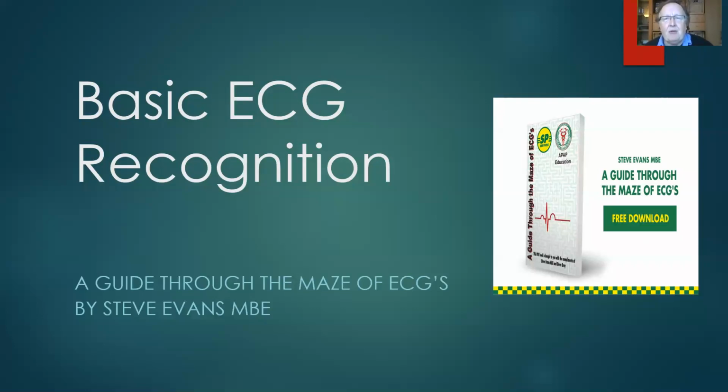And the other thing to remember when dealing with ECGs, it's only one piece of a 10-piece jigsaw. When you're trying to work out what's up with your patient, you need to get all the pieces, or as many pieces of the jigsaw together as you possibly can. So you're going to look at the levels of consciousness, their pulse rate, their ECG, their blood pressure, their pulse oximetry, their breathing rate, their BM, their peak flow, the past medical history.